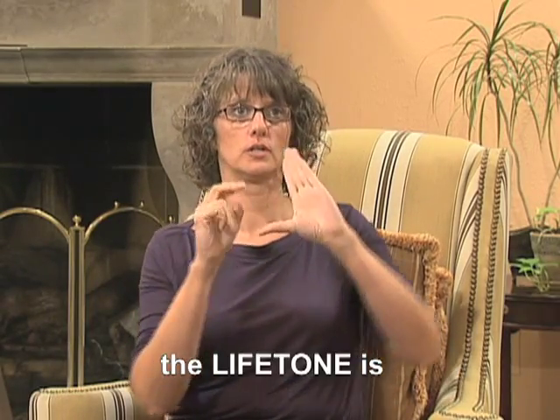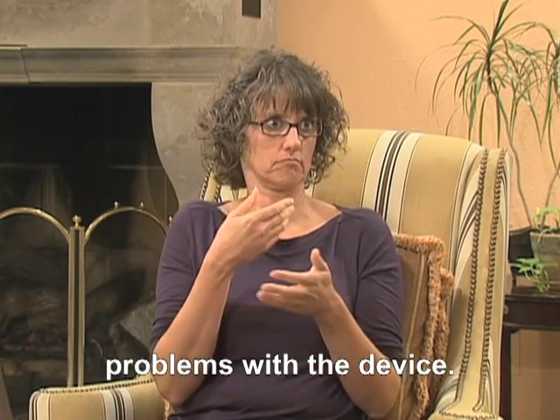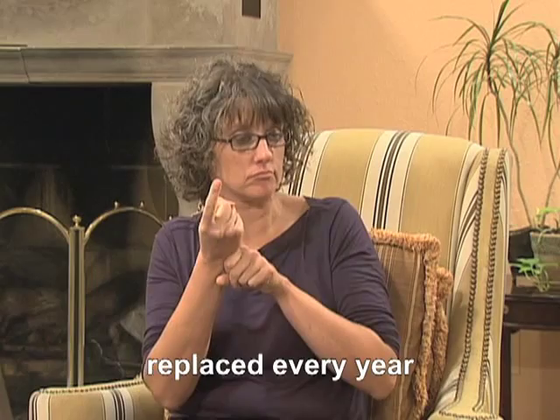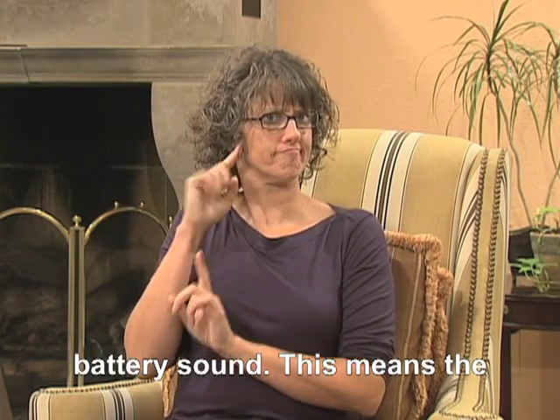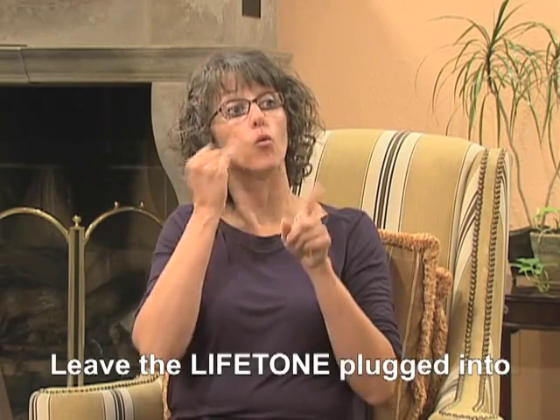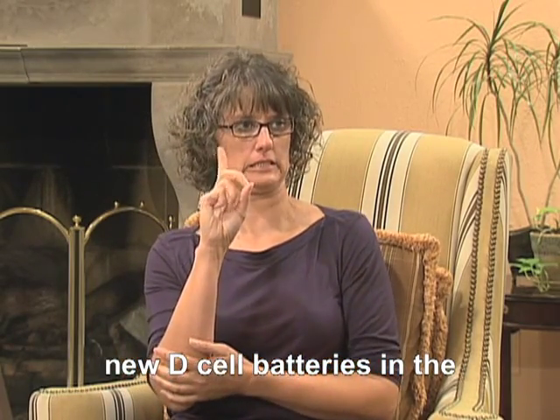The display on the Lifetone is key to understanding any problems with the device. For example, the backup batteries need to be replaced every year or when the display flashes B-A-T-T. Someone who is hearing will also hear a low battery sound. This means the batteries need to be replaced.